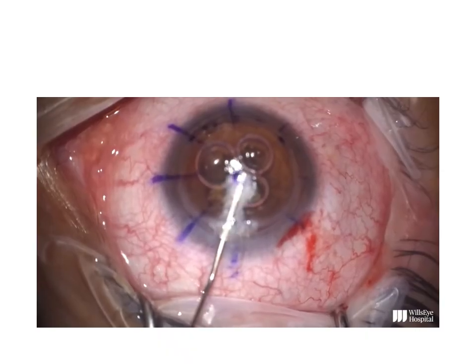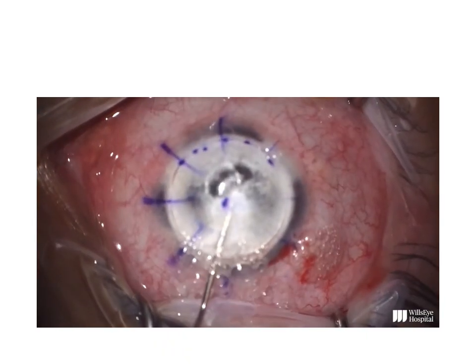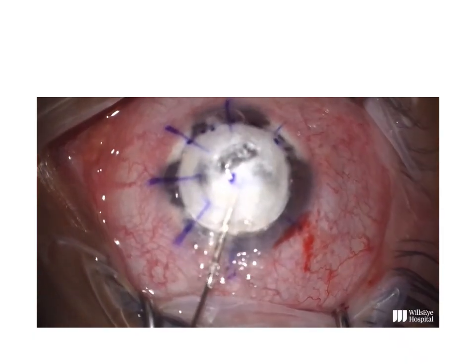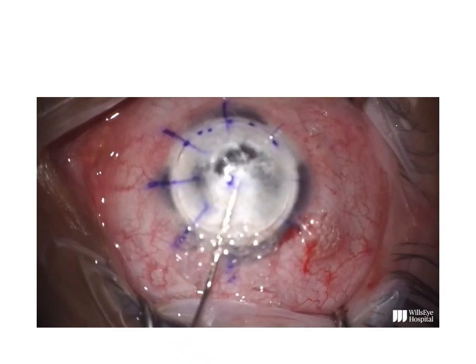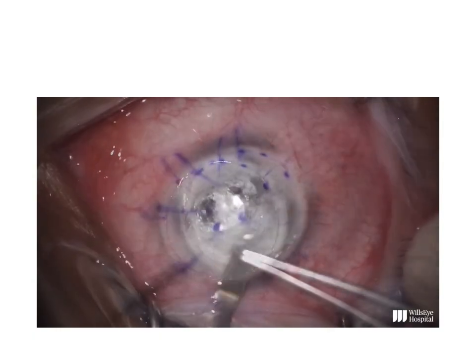That is the big bubble, a type 1 big bubble being formed. See, it is inside the stroma. That is why it's white, and it appears explosively as the air is pushed. That's the type 1 big bubble. Next, a groove is made.